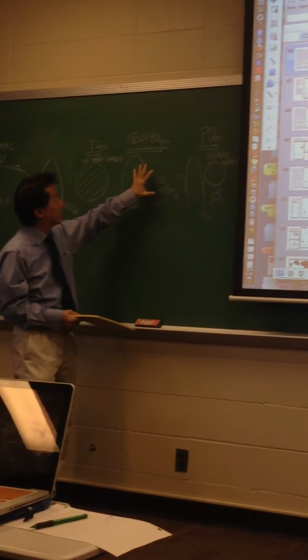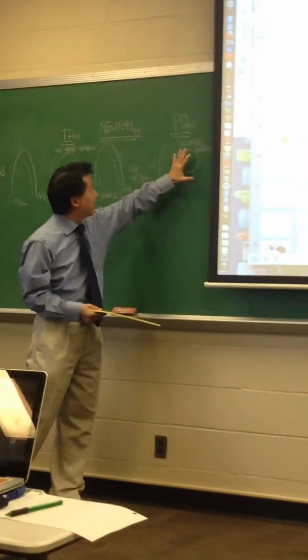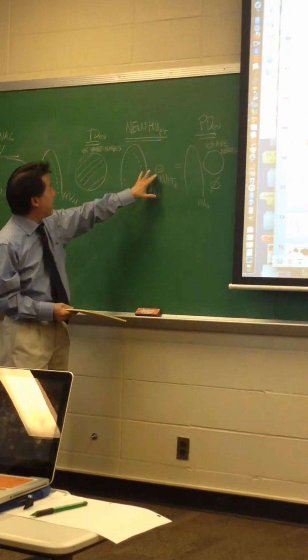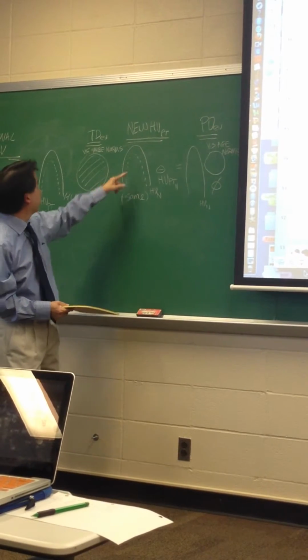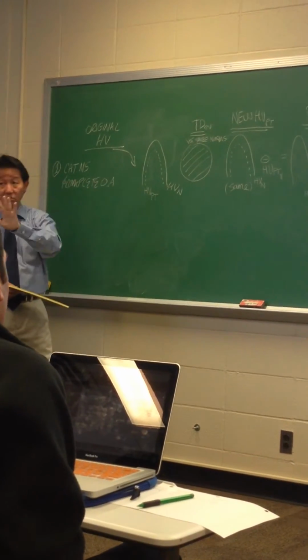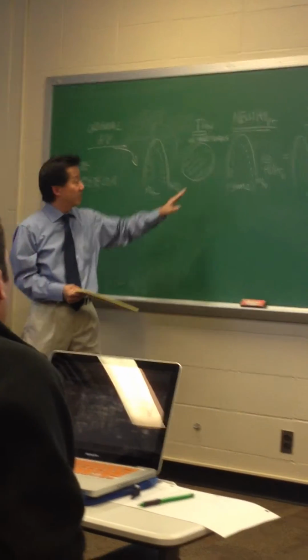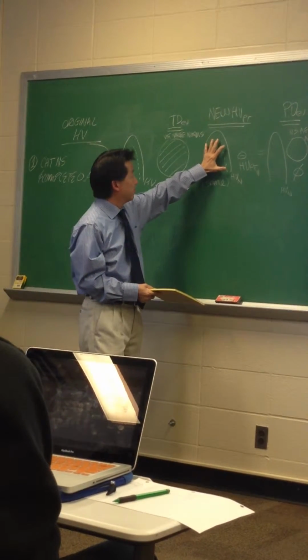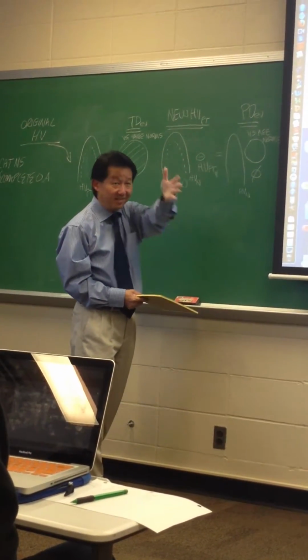And then what the pattern deviation is, it has this other step before it does the same thing. So this step and this step are the same, but before that, it actually subtracts out the patient's hill of vision, which in this case is the same because it's uniform. There's no recalculation needed, it's just equal loss across the field. So it just takes this away. Visually, this curve should be the same as that. I just crunched it up because the angle was bad.